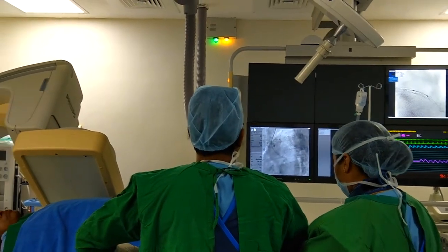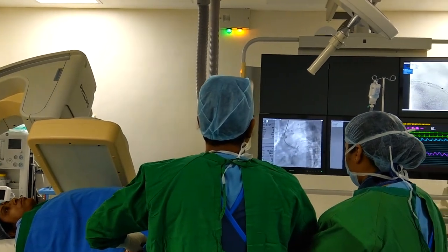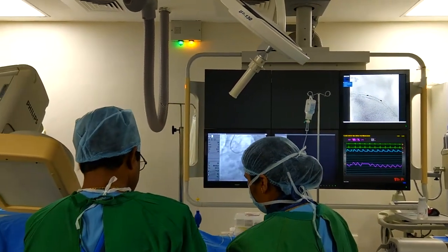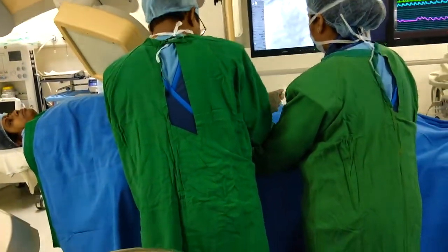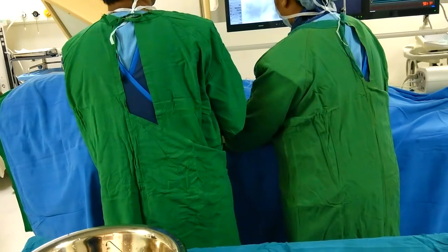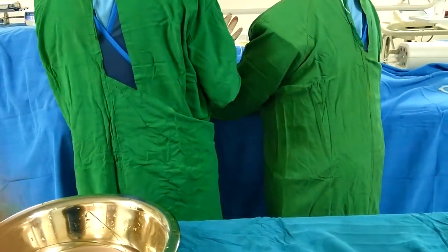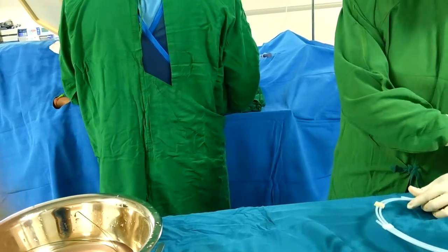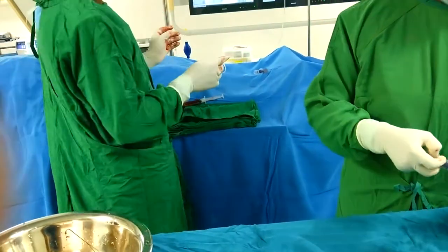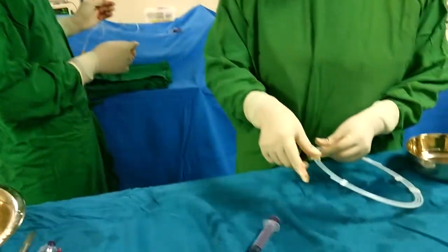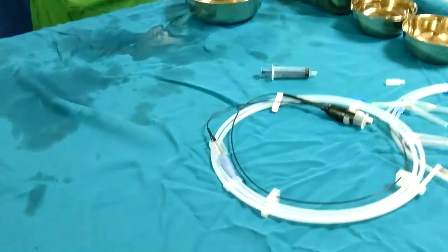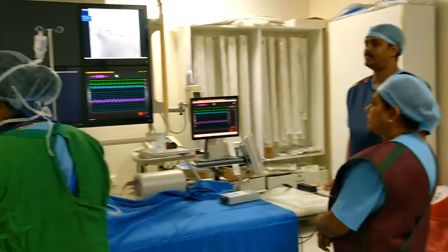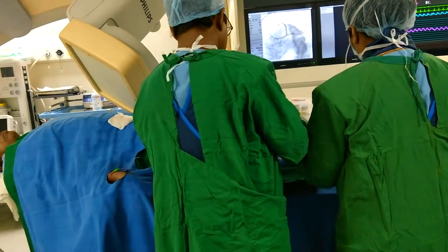This device is recently developed in interventional cardiology. It helps to understand whether the stent is properly deployed and properly opposed to the arterial wall. It is routinely used in left main stenting, calcific lesions, and bifurcation lesions.